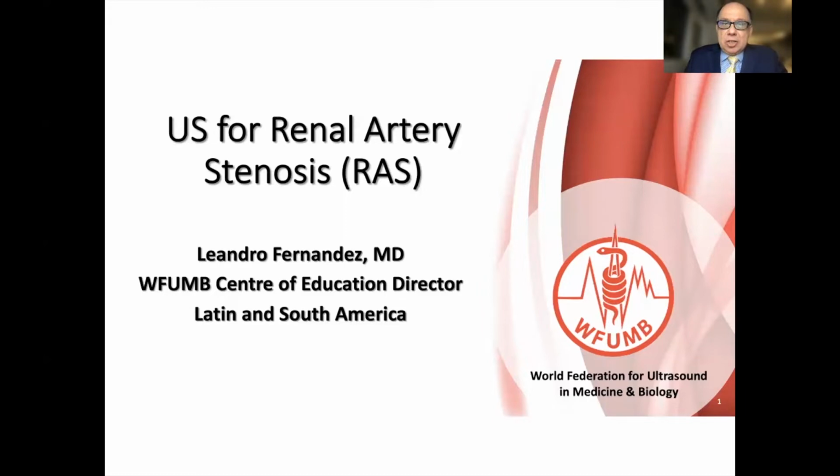It is my privilege to have the opportunity to discuss the topic ultrasound for renal artery stenosis. I'm Leandro Fernandez from Venezuela, and I'm WFUMB Center of Education Director for Latin and South America.